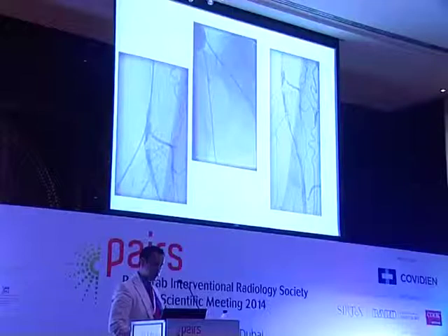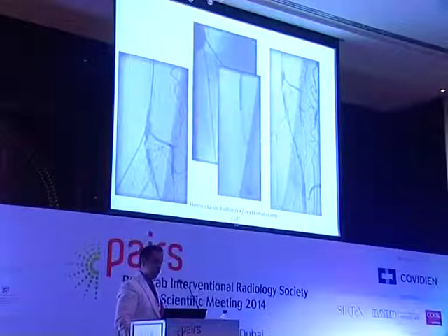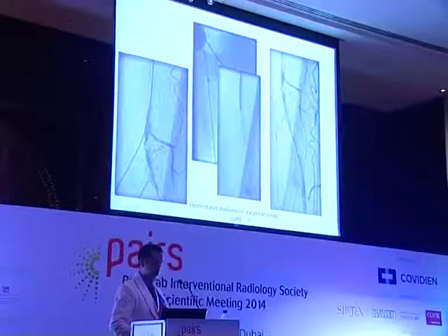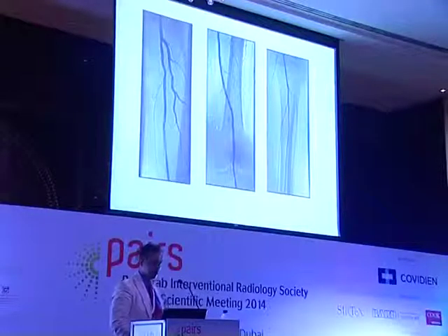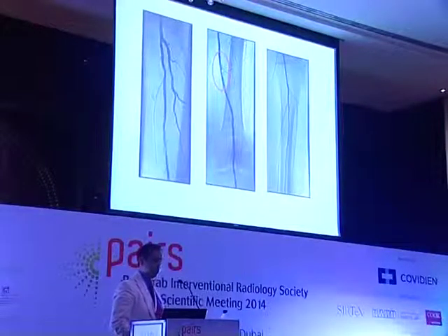Here you can see it down in the P1 segment, all the lesions, and we could continue with the procedure after doing the hemostasis with a balloon angioplasty and combine with the external compression like a cuff. Here is the final result with total recanalization of the SFA until FEMPOP area and 2 vessel runoff, without any bleeding in the puncture site, even if we use a sheath.